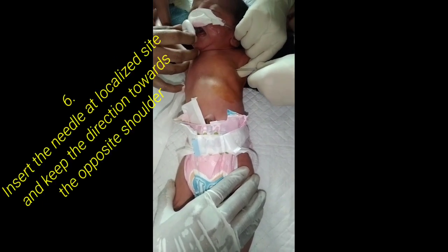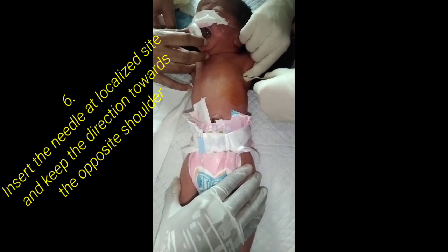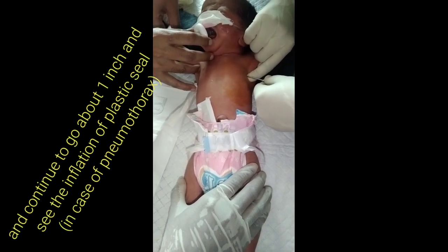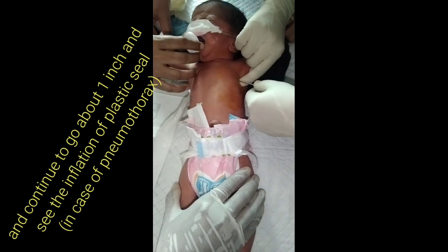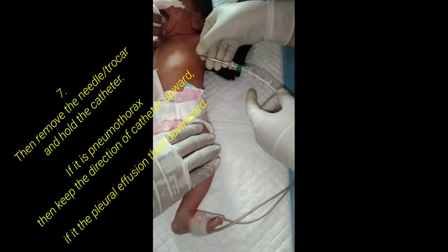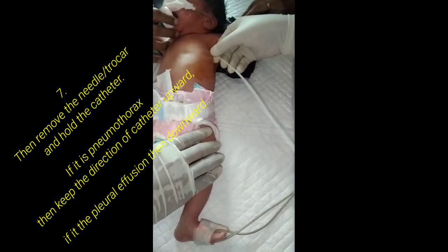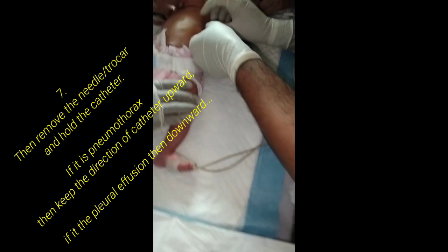Sixth: insert the needle at the localized site and keep the direction towards the opposite shoulder. Continue to advance about one inch and observe the inflation of the plastic seal in case of pneumothorax. Seventh: remove the needle or trocar and hold the catheter. If it is pneumothorax, keep the direction of the catheter upward; in case of pleural effusion, direction downward.